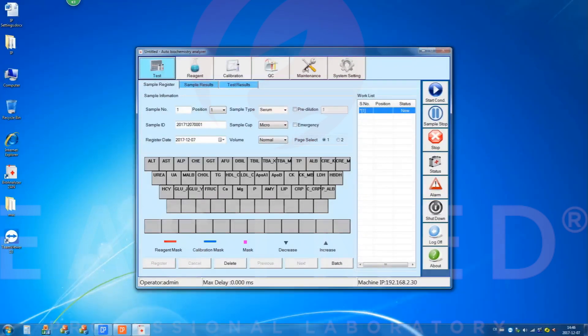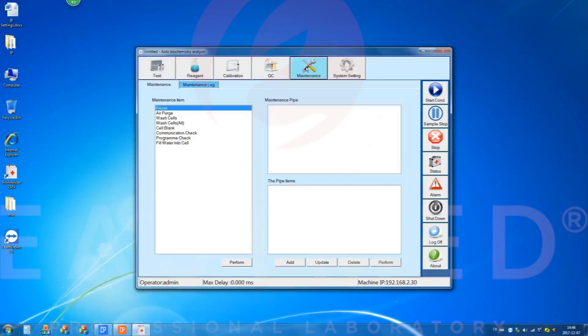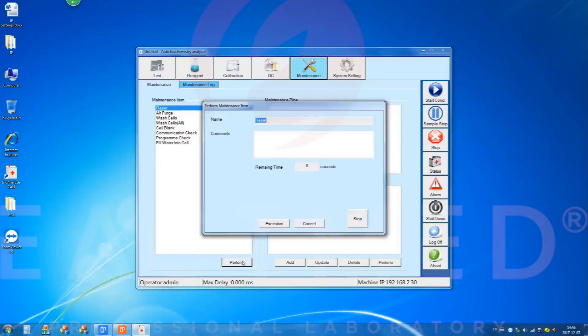Click to enter maintenance and execute the reset function. All moving parts of the instrument will be reset. Check if all functions are working properly.